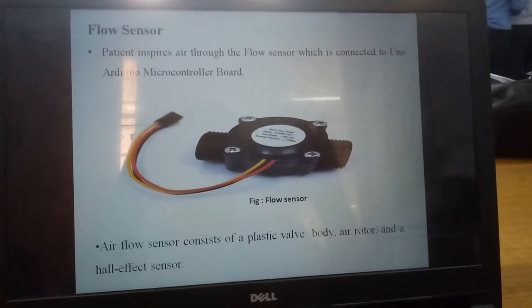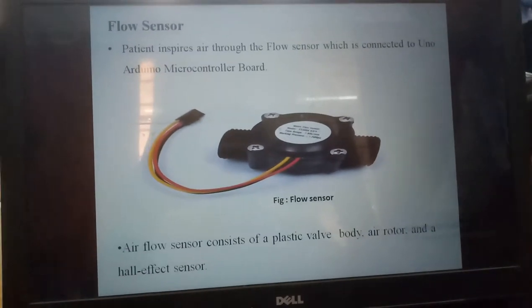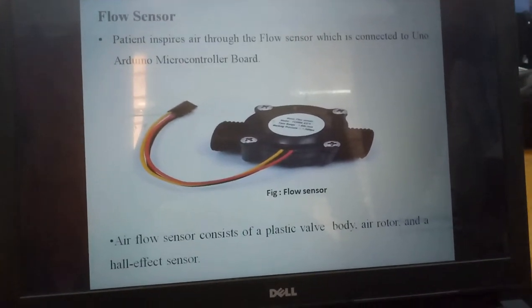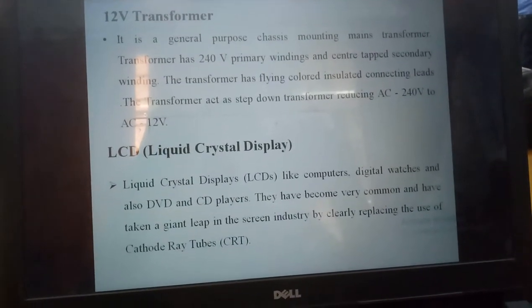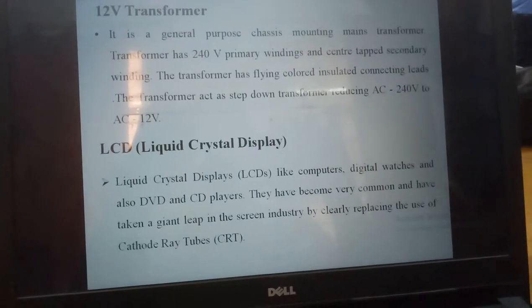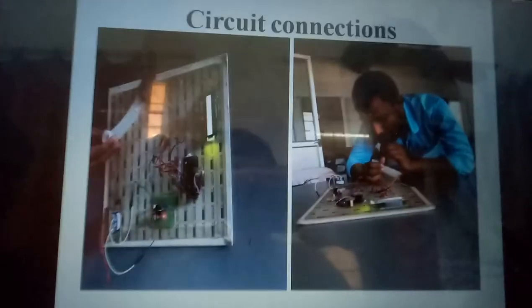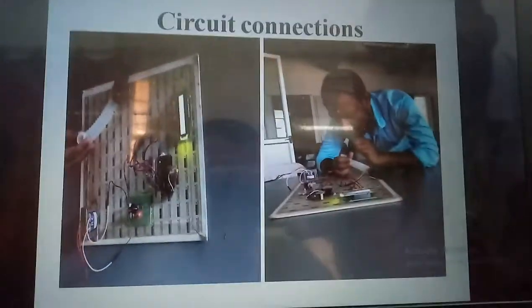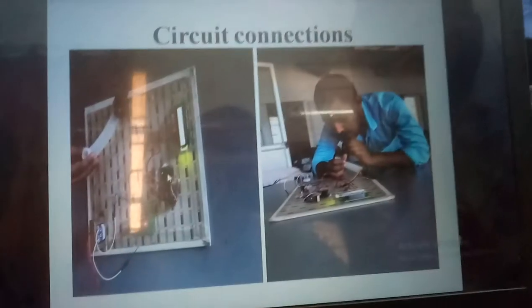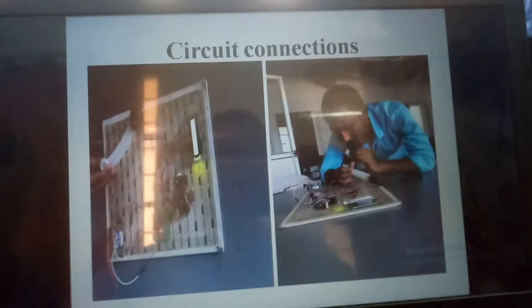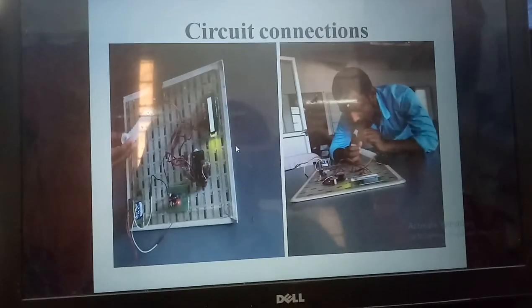This is the plastic valve body. The flow sensor converts — it converts mechanical energy to electrical energy. It is called a flow sensor. This is the total circuit connection of our project. We have connected all parameters: LCD display, flow sensor, and power supply. This is the connected project.